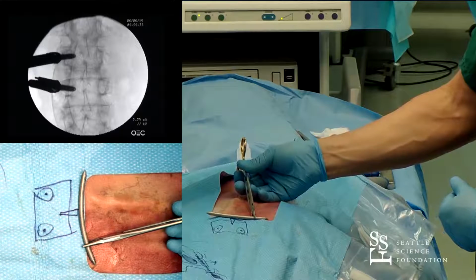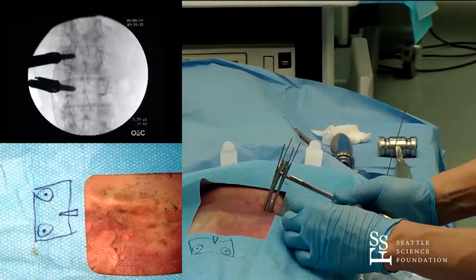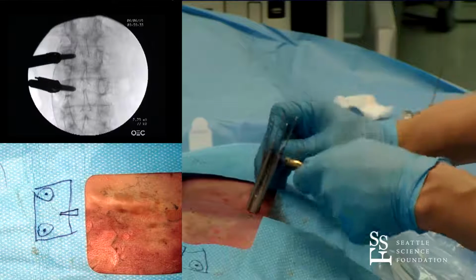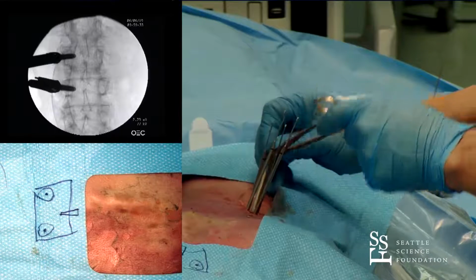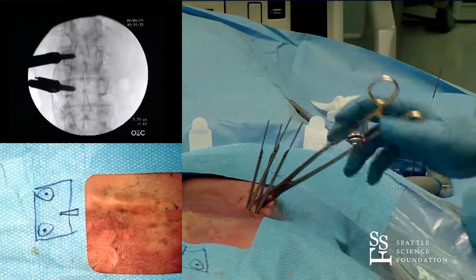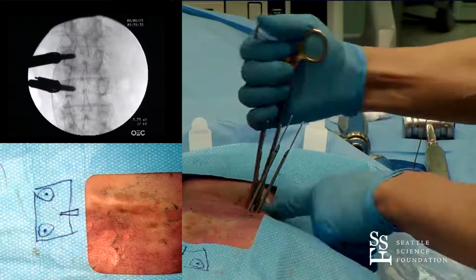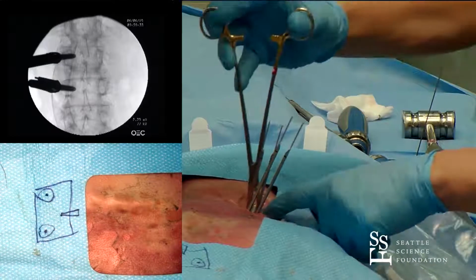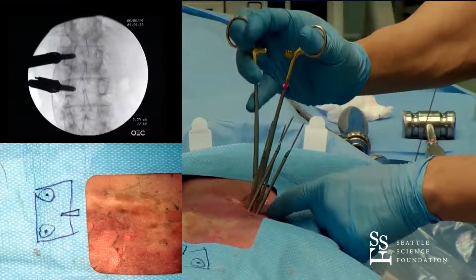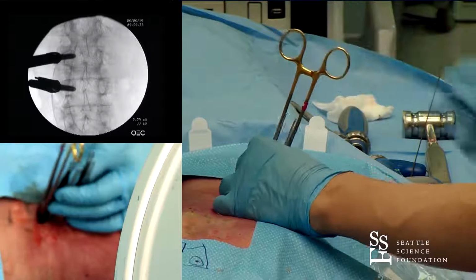okay, and then we're going to tunnel the rod, okay? So if you watch, we're going to put the rod in, okay, and then we're going to tunnel it all the way across, deep in the soft tissue, okay, to the other level, okay? So we haven't made an incision specifically for the rod. And this is kind of long, so we're going to have to bring it in and out. Good. Perfect.